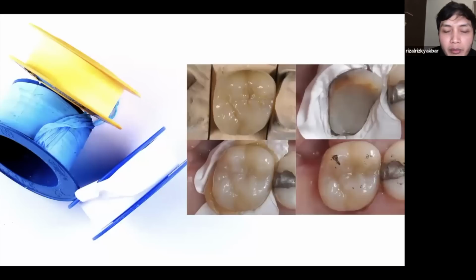What I like the most about the plumbing tape, this is the example. I have a patient who is allergic to latex, to the rubber dam. So you can even use the plumbing tape as a modification of the rubber dam.